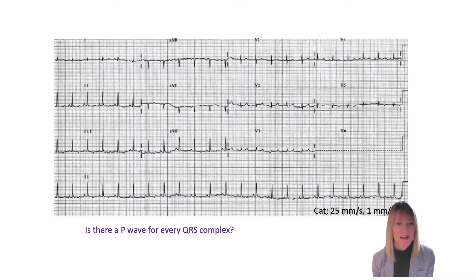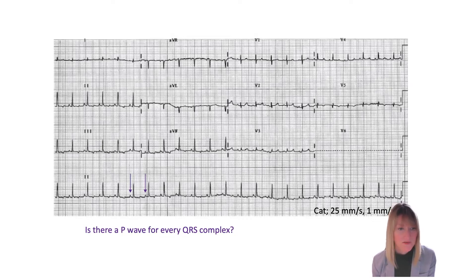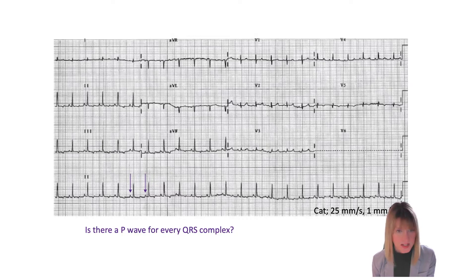The next question I'm going to ask myself is: is there a P wave for every QRS complex? I'm going to identify the P waves here — those small deflections that initiate each heartbeat. As I scan across from left to right, I do think that there is a P wave in front of every one of those QRS complexes. So that's a statement worth noting.